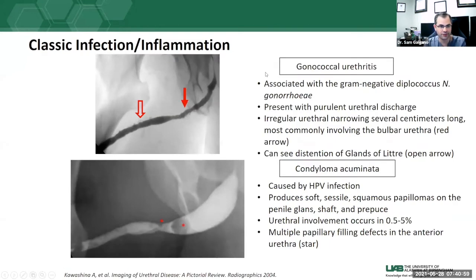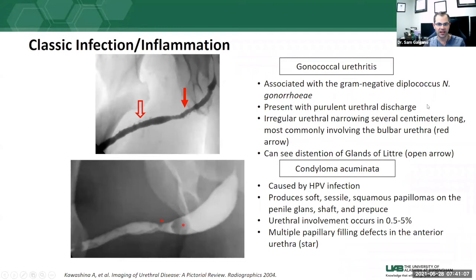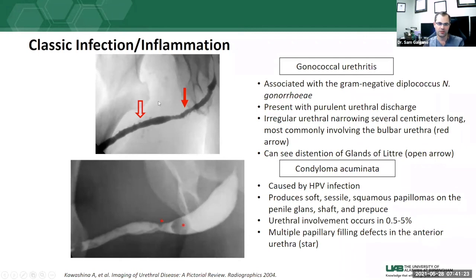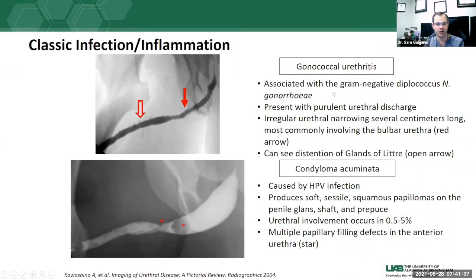Other classic infectious or inflammatory urethral conditions: gonococcal urethritis, associated with gonorrhea, typically presents with purulent urethral discharge and shows irregular urethral narrowing several centimeters long. Notably, prominent glands of Littré on urethrogram are a red flag for gonococcal infection — it is nonspecific but should raise suspicion. Labs, urinalysis, and swabs can confirm gonorrhea. If you see a lot of glands of Littré, consider gonococcal urethritis.